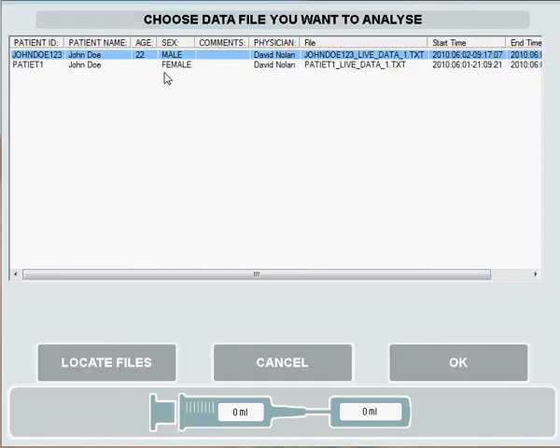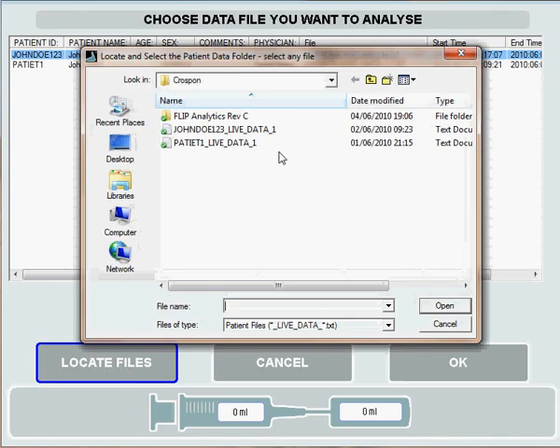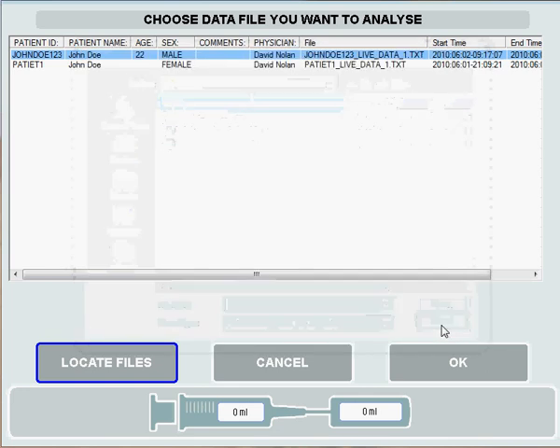You'll see that two patients already exist here. Flip Analytics automatically remembers the last folder you were in and pulls in patient details from that folder. If you'd like to pull in patient details from a different folder or perhaps from a USB key, you can press Locate Files, find where the files are, press the file and press Open to bring them in.